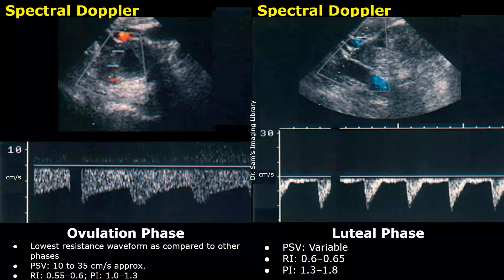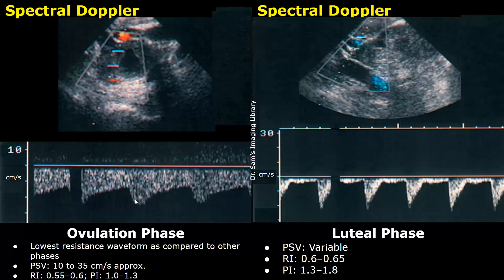The next phase is the ovulation phase. The waveform has the lowest resistance as compared to other phases. We can see a broad waveform with broad peaks. A low resistance blood flow is seen because there is an increased demand by the dominant follicle for blood. The values of PSV, RI, and PI are similar to those seen in the late follicular phase.